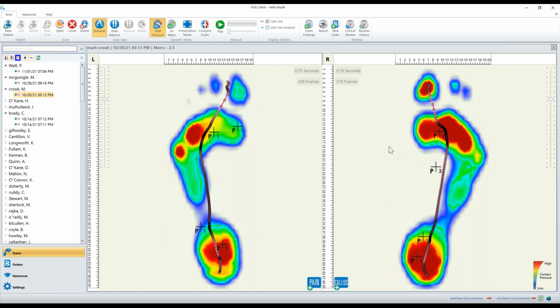Being a podiatrist, I work very closely with a number of different physicians, a chiropractor and a physiotherapist, and I would send them the scan and say, would you investigate, have a look at the SIJ, have a look at pelvic stability and whatnot, and they will investigate that. But I always refer this to whichever one has sent the patient to me.